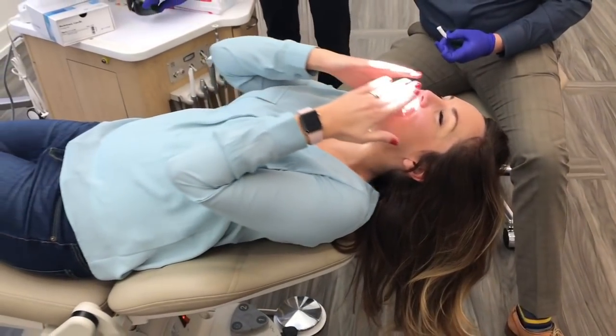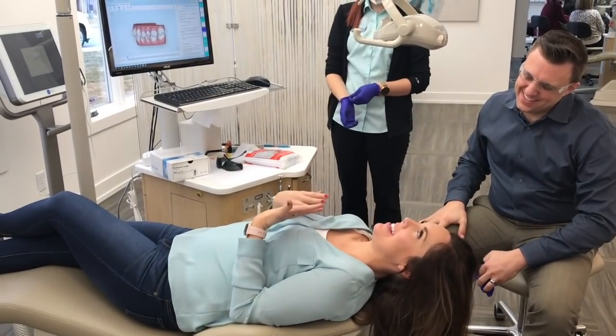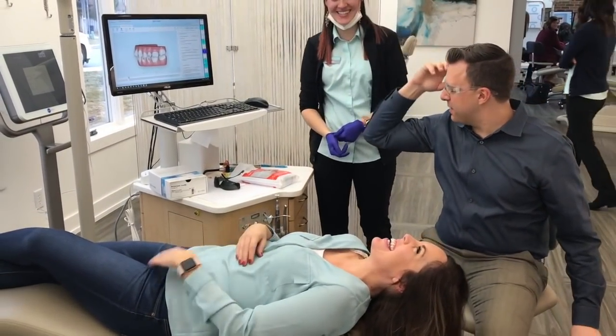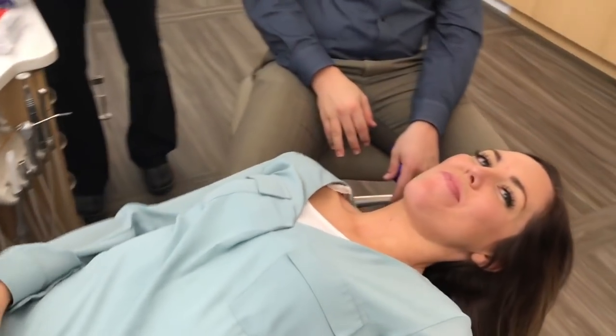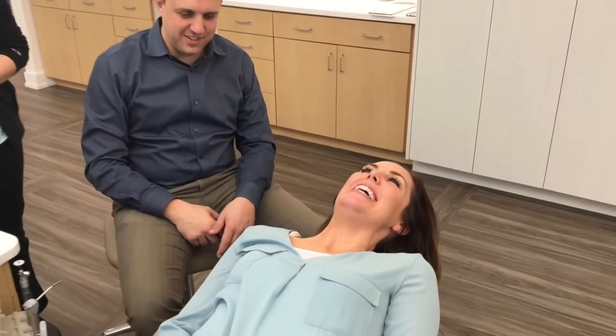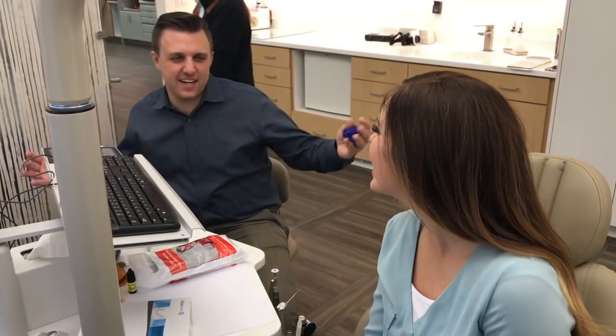Feels good — oh, listen to me talk! It will take a little while to get used to it, just a couple of days. Let's see — it's going to take some time. You can't even see them! That's amazing. So much different than braces back in the day.